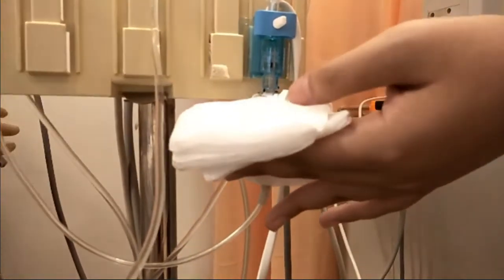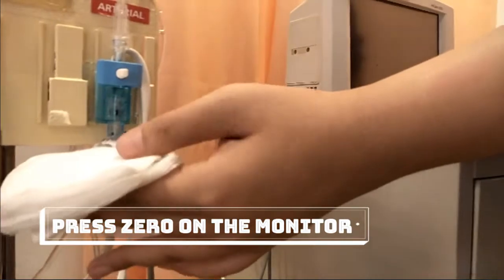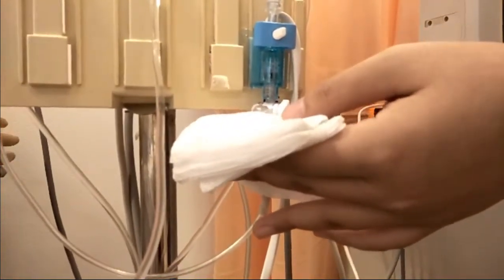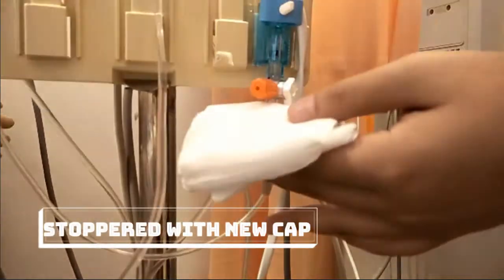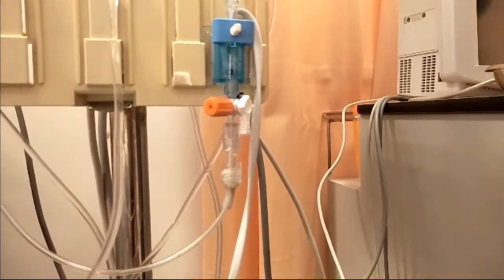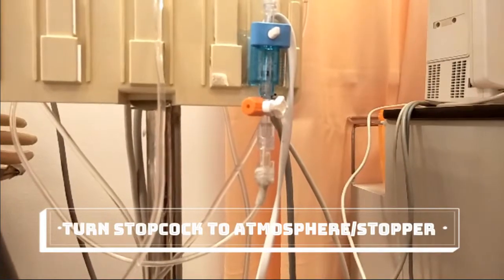And then, on the monitor, press 0 and water will flow out. Then, use a new cap and close the tube. Then, return the stopcock back to the neutral, which is the atmosphere.